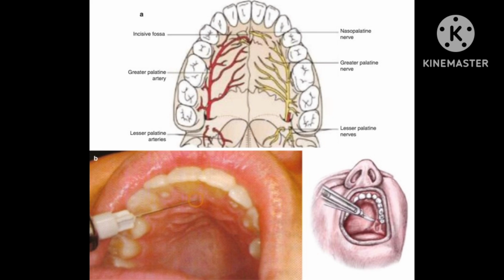Anesthesia of the palatal side. A supplementary injection in the palate is necessary for pain-free procedures such as extractions, gingivectomies, or scaling. The palate has attached gingiva, which is difficult to inject into, providing more resistance and greater pain. The patient should be warned.